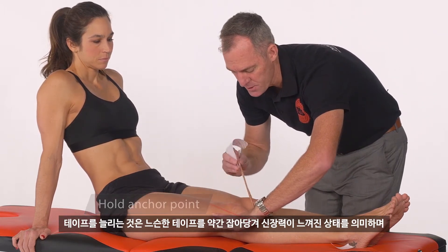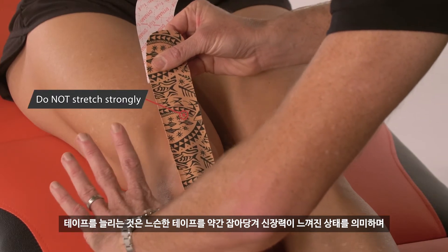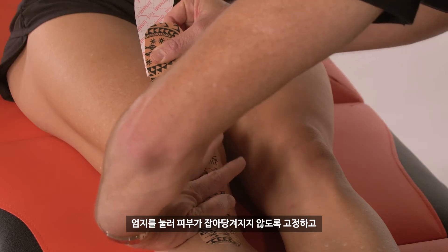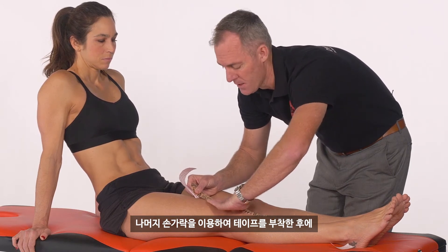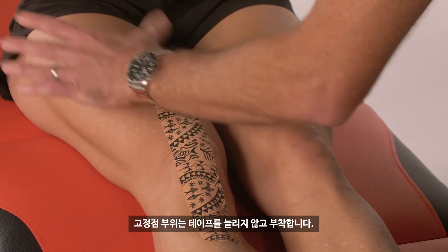Tension slightly back in the opposite direction as you take up the slack in the tape. Then while the thumb still has pressure applied, use the fingers to stick down the rest of the tape, or as much of the tape as you can. Then apply the other end — the other anchor point — without any tension.